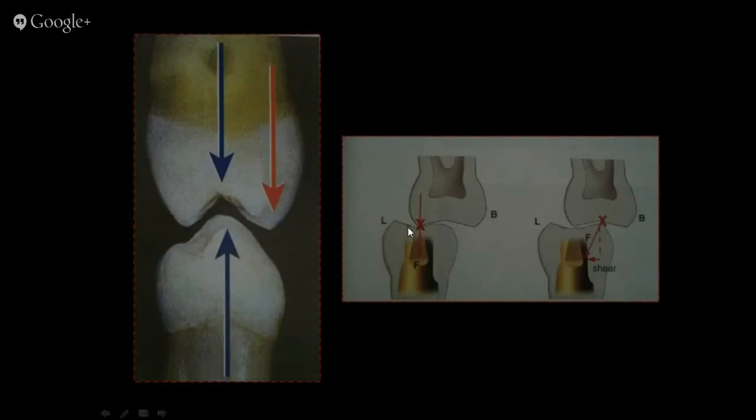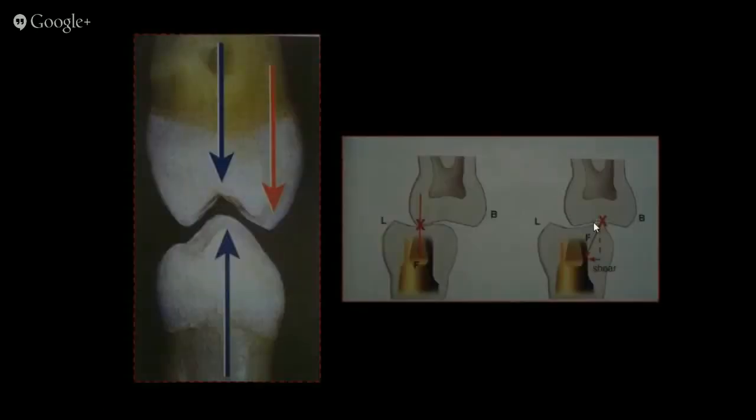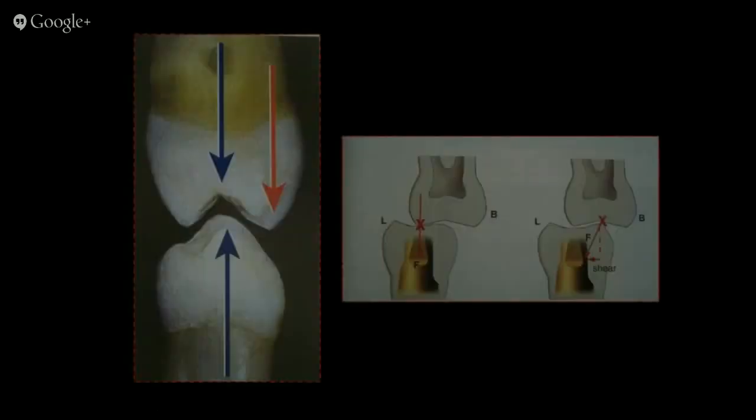In my lateral excursion, that is left or right side, there is a possibility that the cuspal tips or the cuspal inclines act as interference, right? So I have to make sure that my cuspal tips are rounded. They are shallow, not pointed, and round like this. That's when I'm going to introduce axial loading.